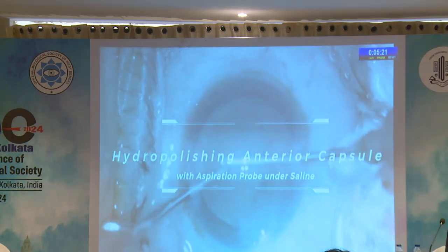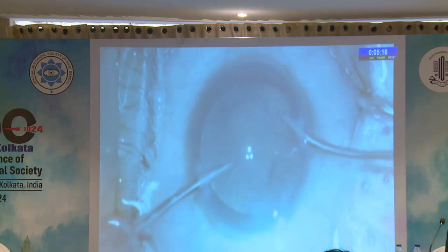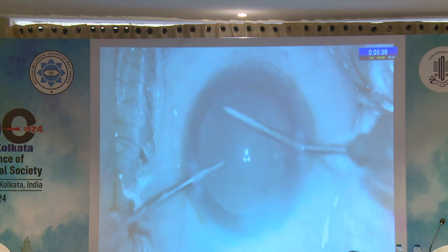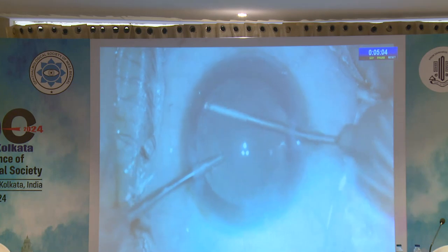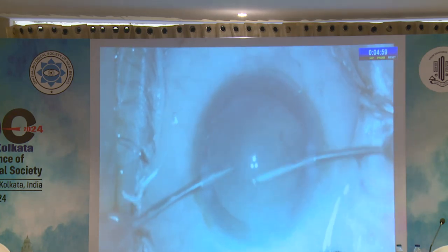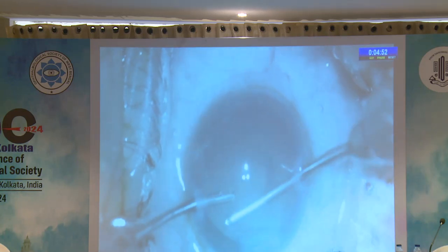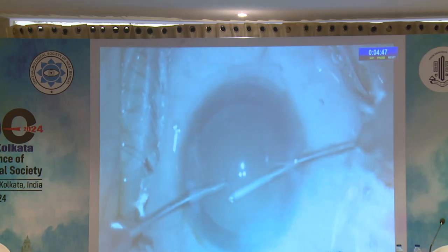The next case is hydro polishing of your anterior capsule. These anterior capsular fibers are quite sticky, they don't come off as easily as you saw with the posterior capsule. The problem in polishing the anterior capsule is that the port of your suction cannula is above. It directly grabs on the anterior capsule and tries to pull it out, and you can have a zonal dialysis, so you have to be very gentle in performing this.